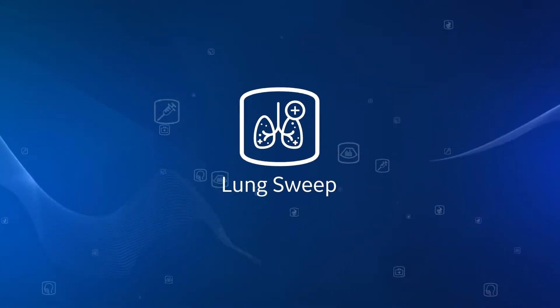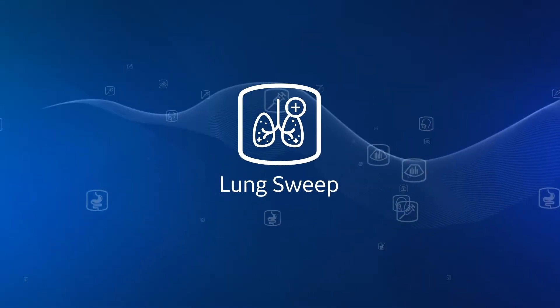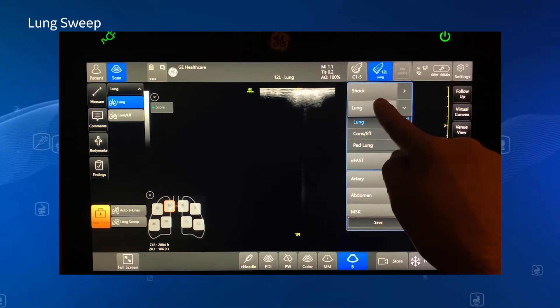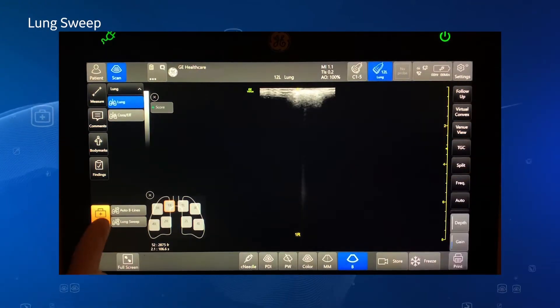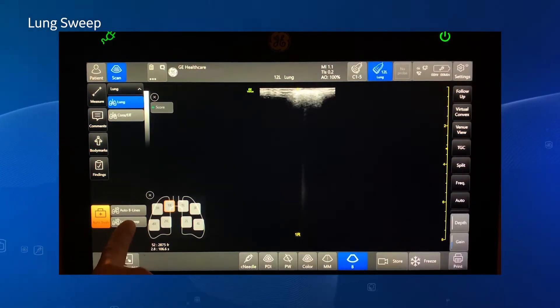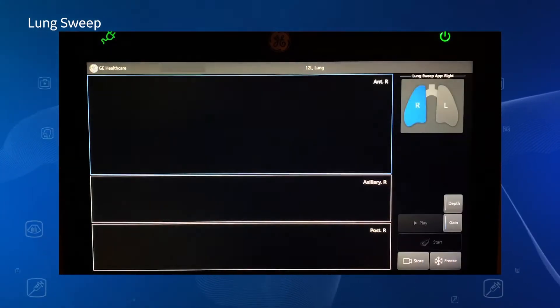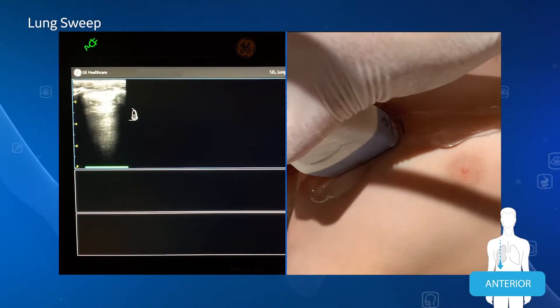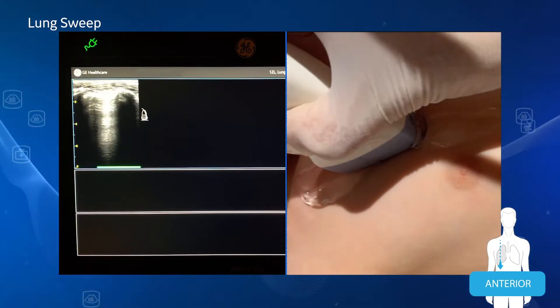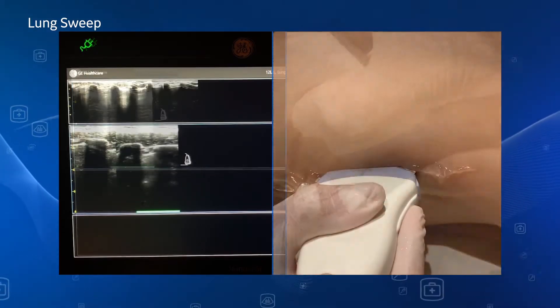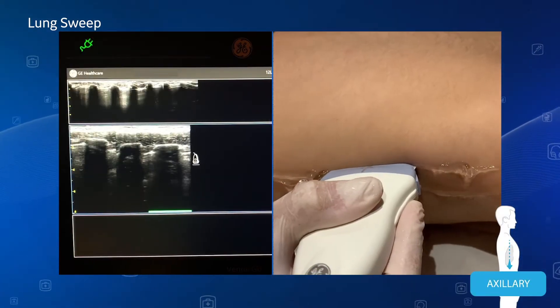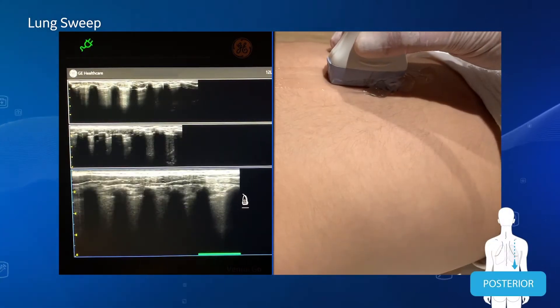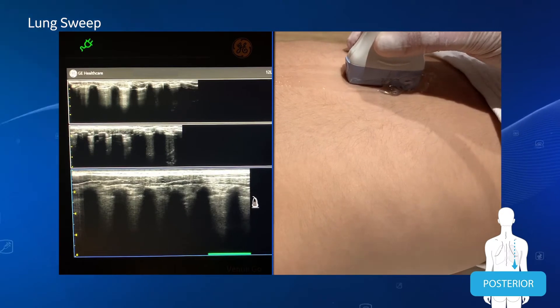Lung Sweep, a rapid visualization tool, provides a dynamic panoramic view of the entire lung in three views: anterior, axillary, and posterior views.